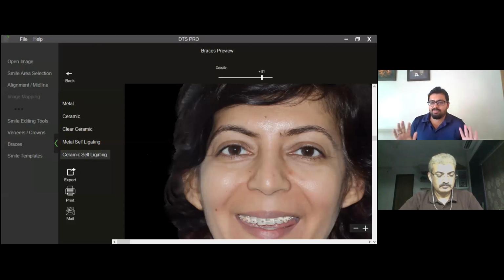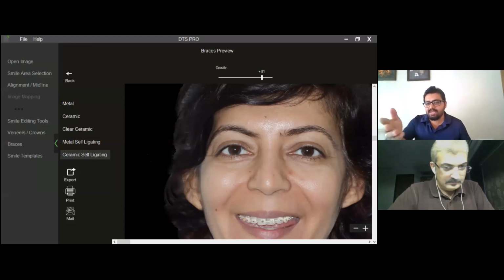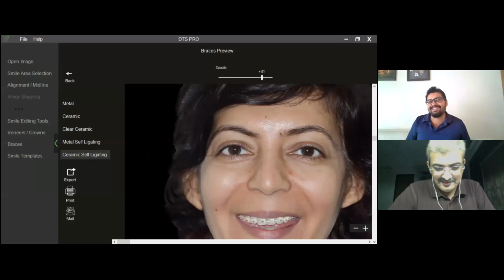Many of us dentists struggle with taking good photographs, so to expect a patient on a virtual platform to just take a selfie is a lot. For that, the Invisalign engine would work better, I would really think, because the Invisalign engine can make odd photographs look good too.